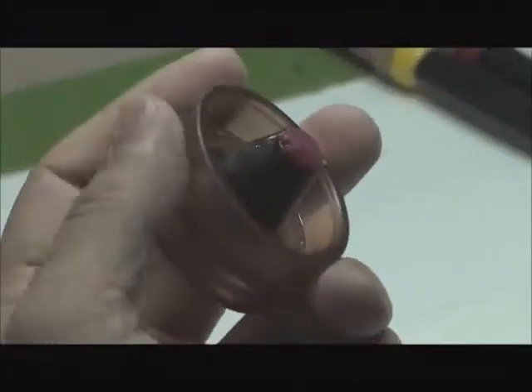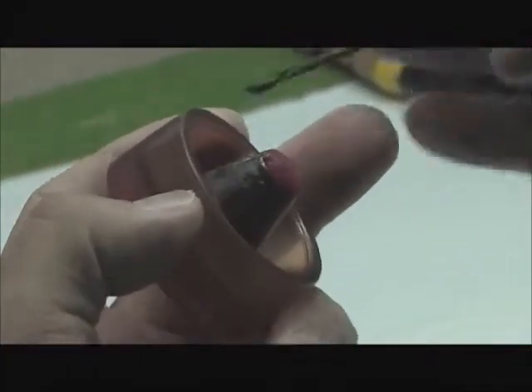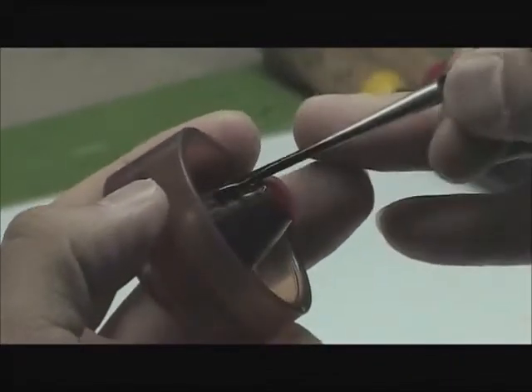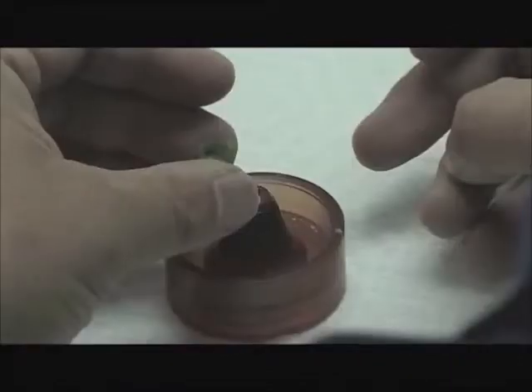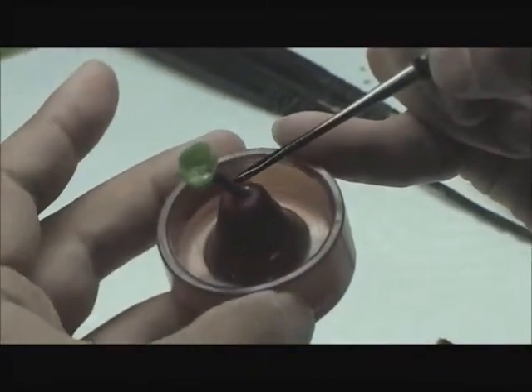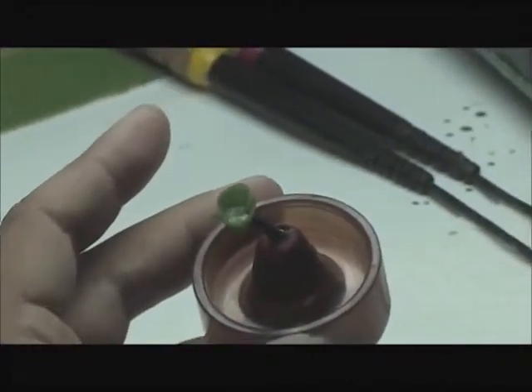Once wax patterns are sprued, they are weighed to calculate the amount of alloy needed for casting. The direct sprue with attached wax patterns is added to the ring base. The connections between the sprue, wax pattern, and base should be free of sharp corners or constricted areas so the molten alloy can flow smoothly and fully fill the mold before cooling during casting.